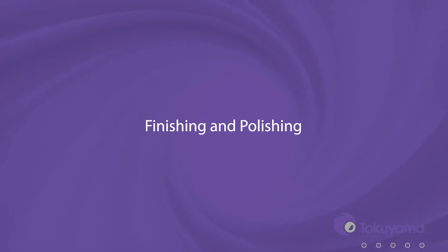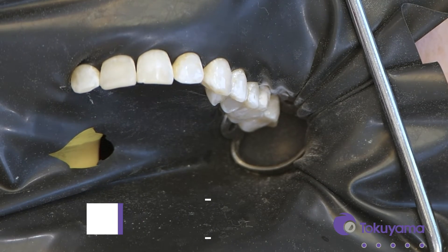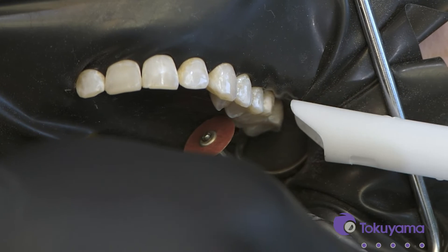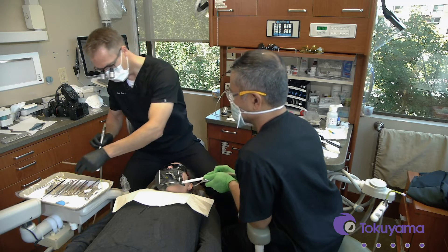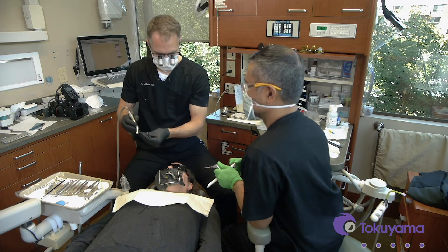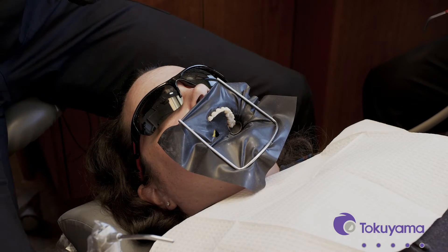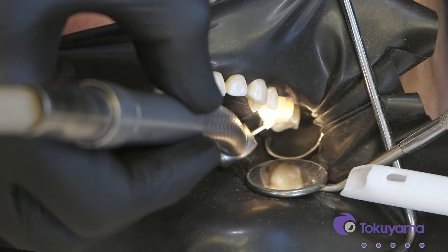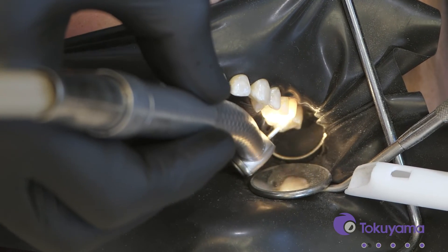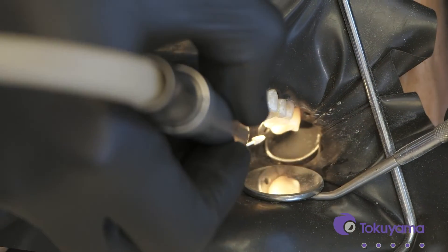I'm going to work on the proximal shape here and put it in. If you don't even bother to add any occlusal anatomy that's totally fine — you would just at this point finish it off, get those edges cleaned up, and be done. It will just blend in perfectly with the color. Looks beautiful. But I like to add a little bit of anatomy, so I'll show you how I do that.